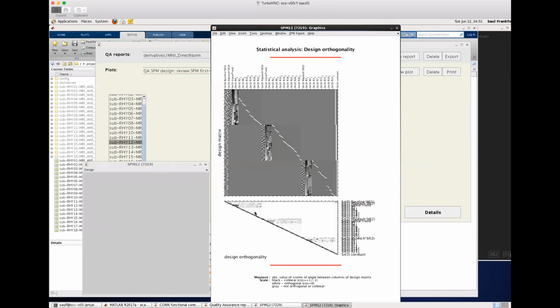because that will allow you to see where the motion is. When you have all of these residual motion effects, they have two potential consequences. One of them is just that they force you to remove a lot of data points, and they also increase the amount of signal that is not defined or well fit by your model. All of those things end up increasing the residual error or decreasing the degrees of freedom, which ends up basically reducing the power. But that is relatively fine. That just gives you more noisy measures.